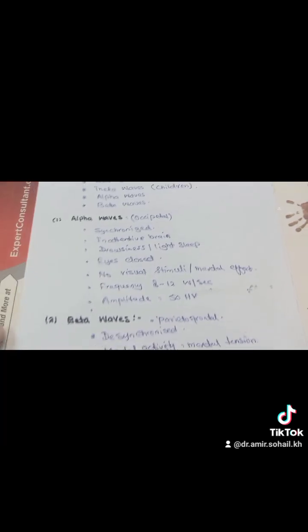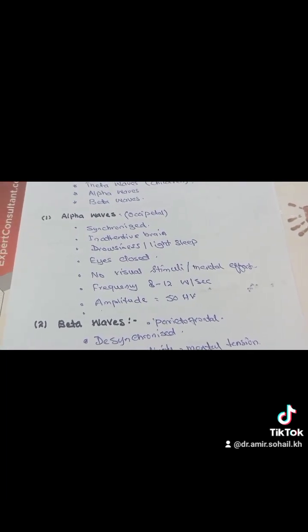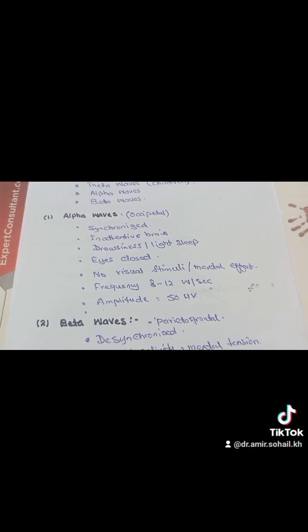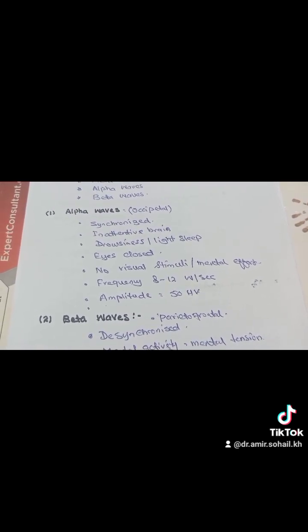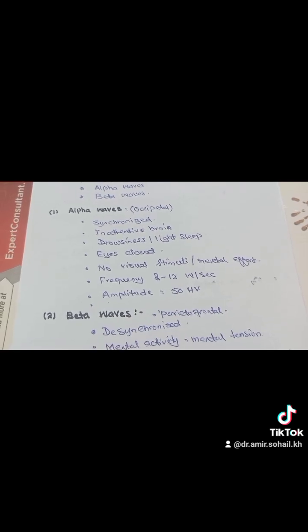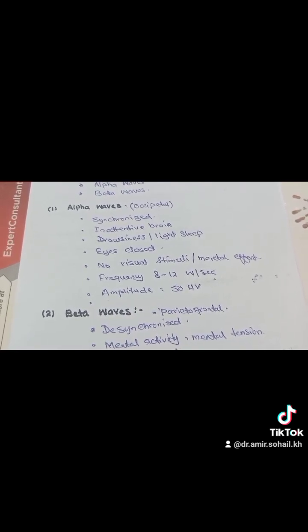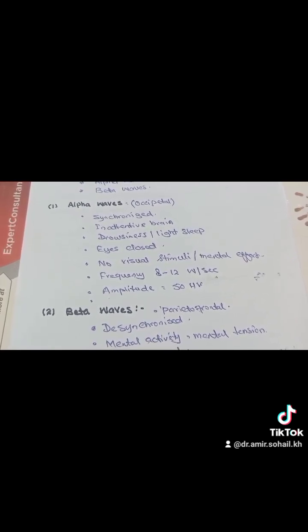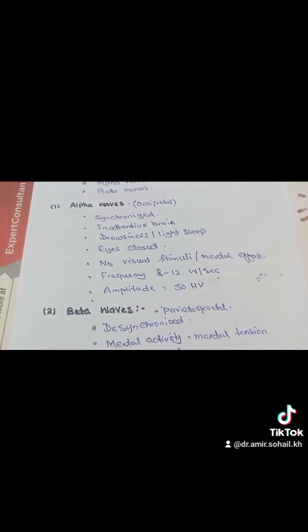Alpha waves. Alpha waves are obtained from the occipital region of the brain. These are synchronized waves seen in an inattentive brain, drowsiness or light sleep with eyes closed, with no visual stimuli or mental efforts. Frequency is between 8 to 12 waves per second and amplitude is around 50 microvolts.